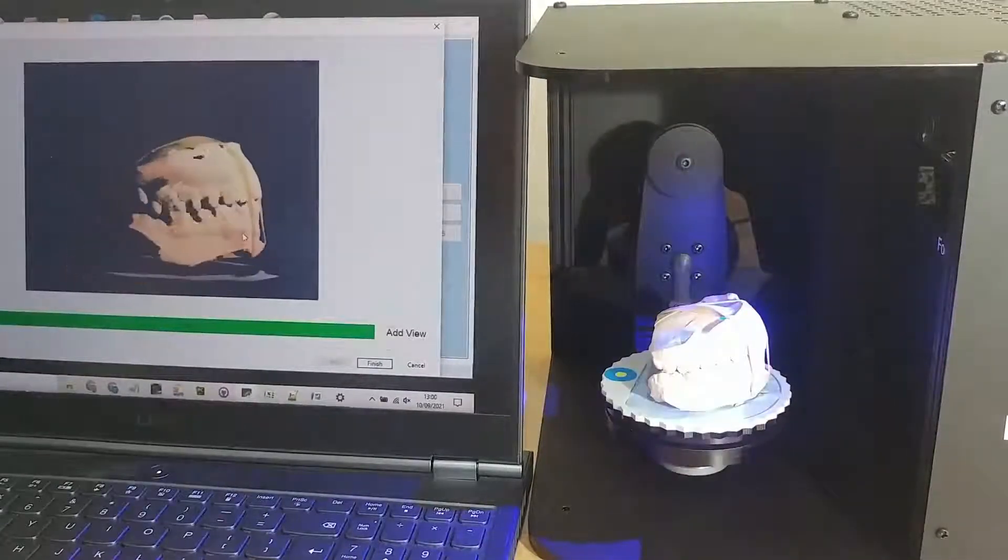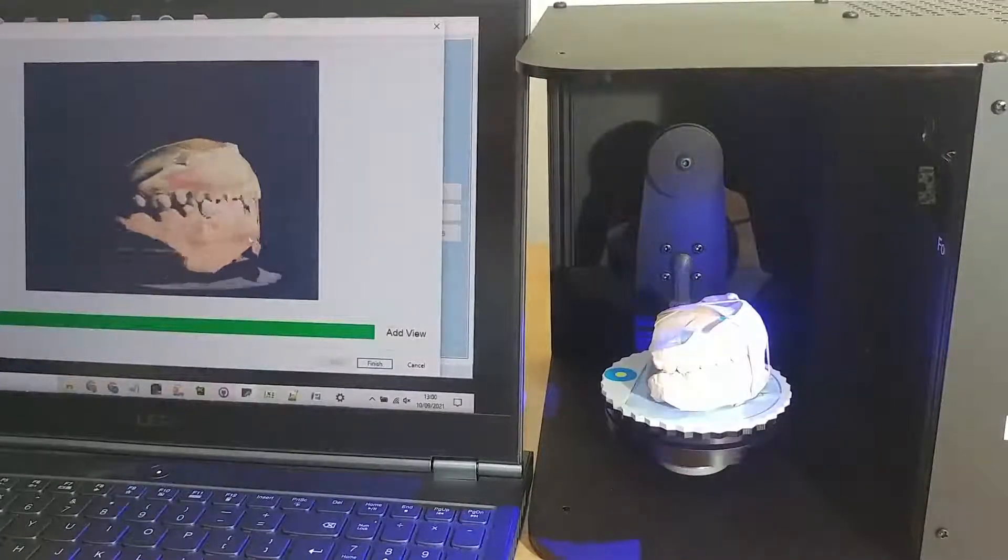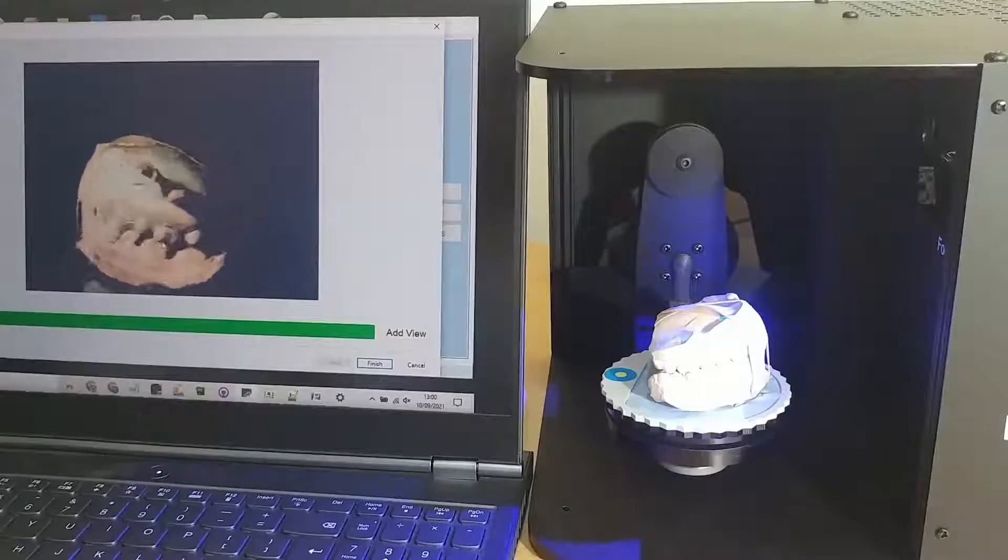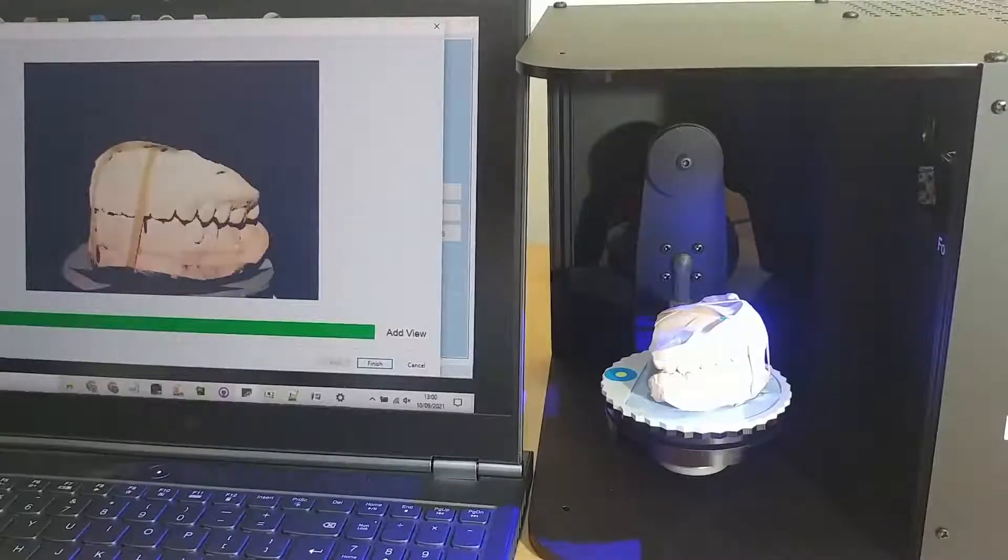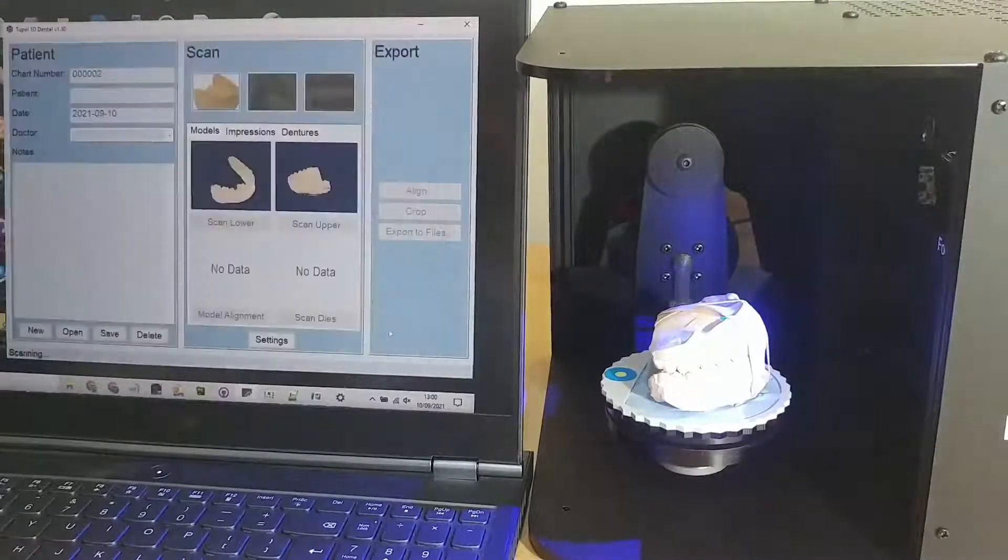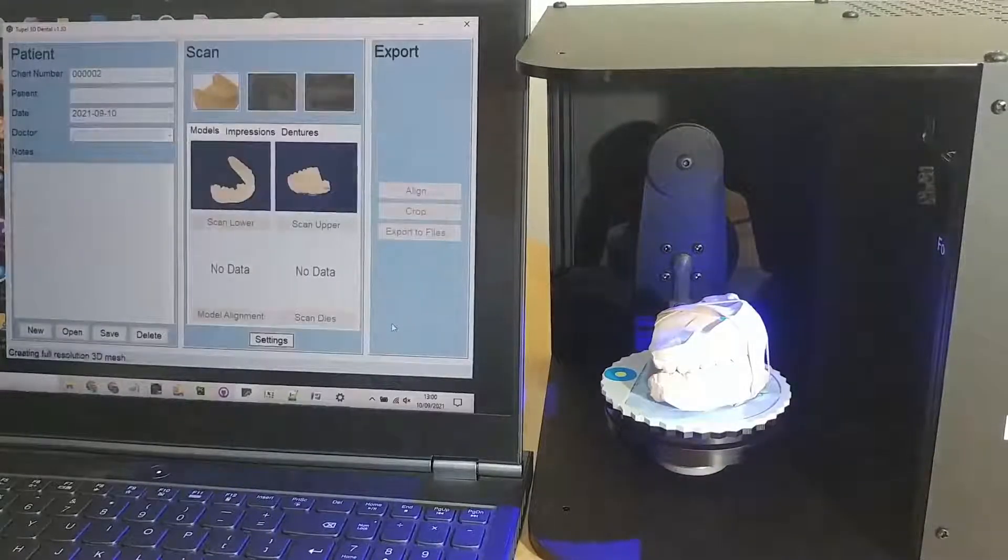You can see that this scan is just a rough scan to capture the alignment between the upper and the lower model. And then we click the align button.